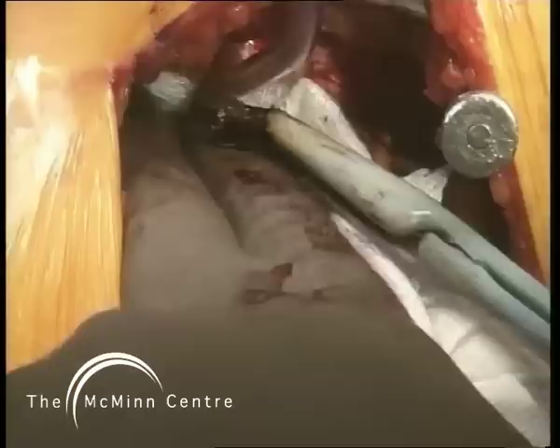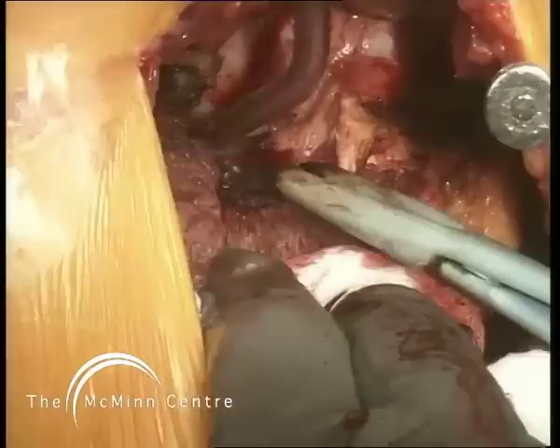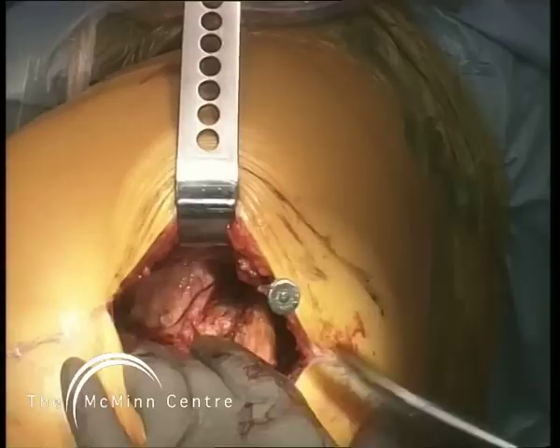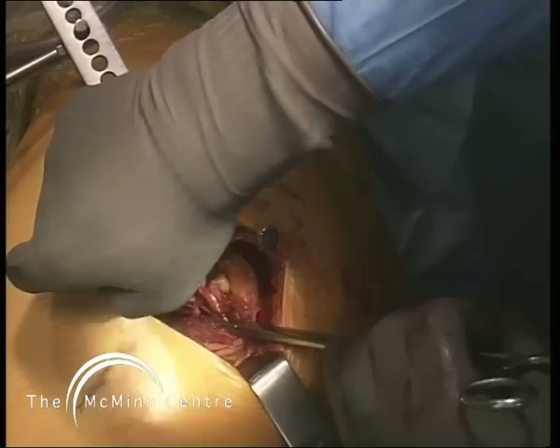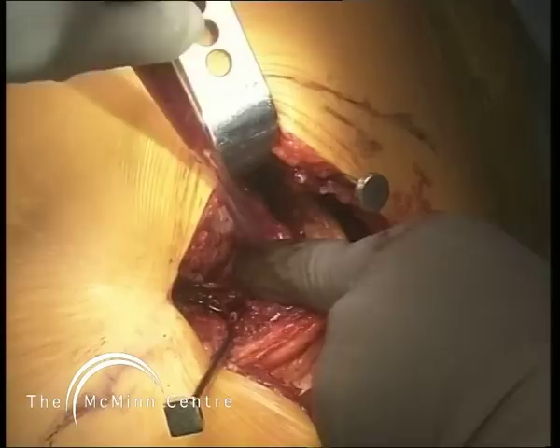We've got bleeders to seal on the back of the greater trochanter and in the muscle mass. The next important trick is to grasp the posterior inferior capsule and make a posterior inferior capsular radial cut, allowing the whole flap of external rotators and capsule to come back and giving much better exposure. I'm now getting onto the ischium and putting a pin about one to one and a half centimeters from the edge of the acetabulum, making sure not to crack off the acetabular edge. So that's our posterior exposure completed.